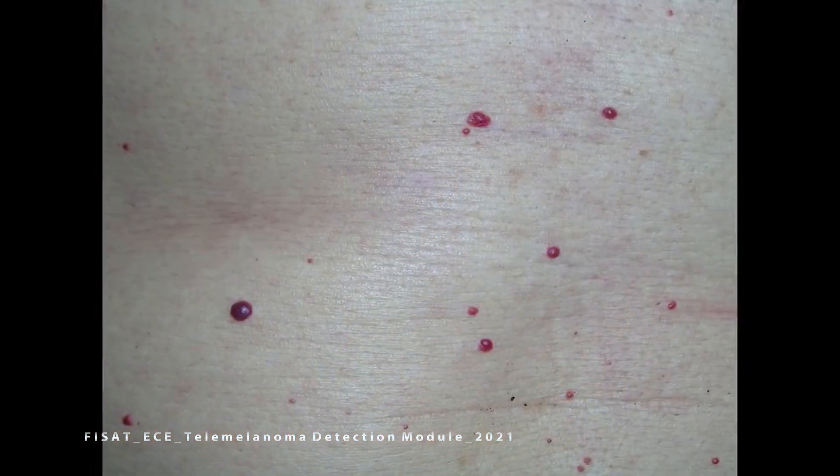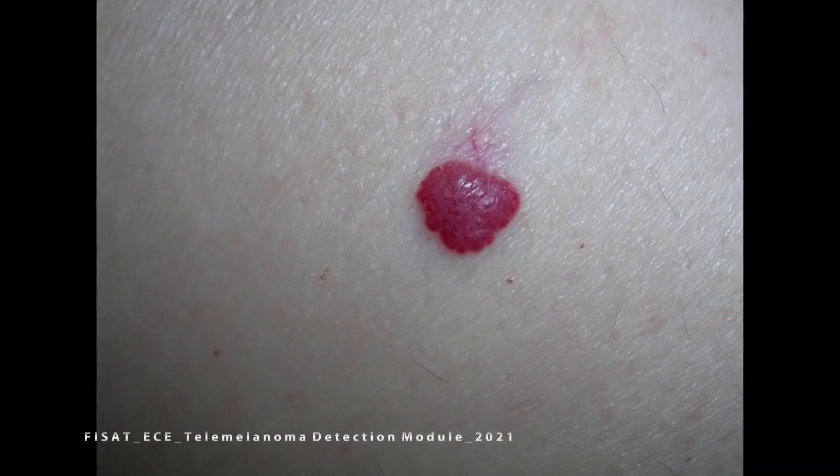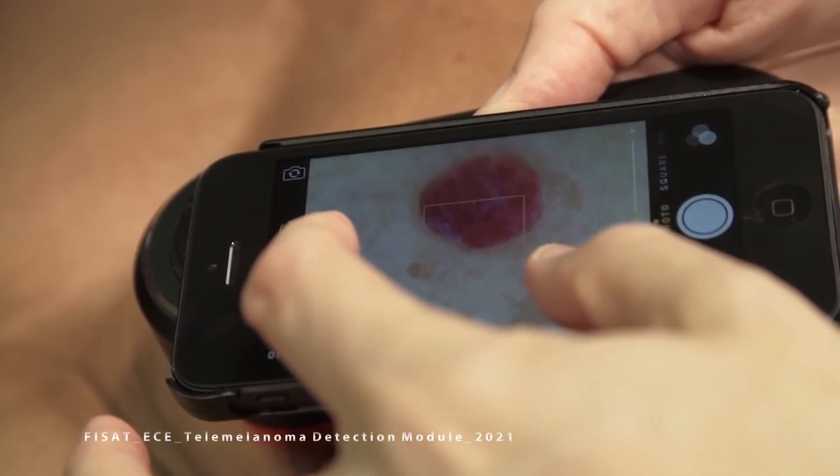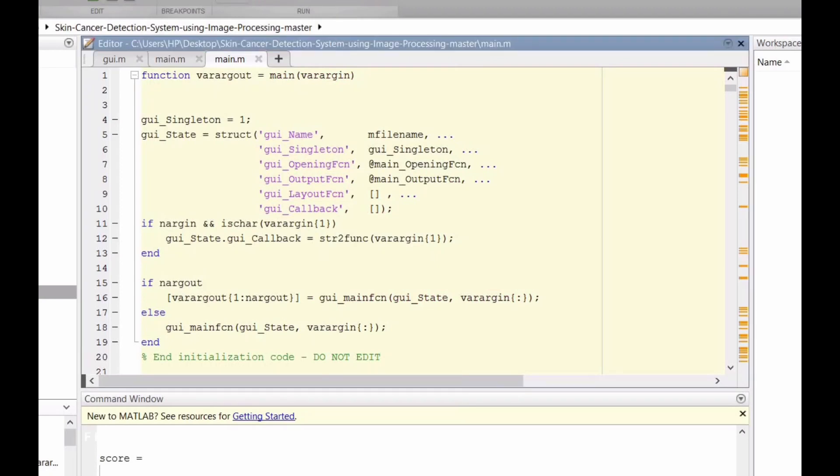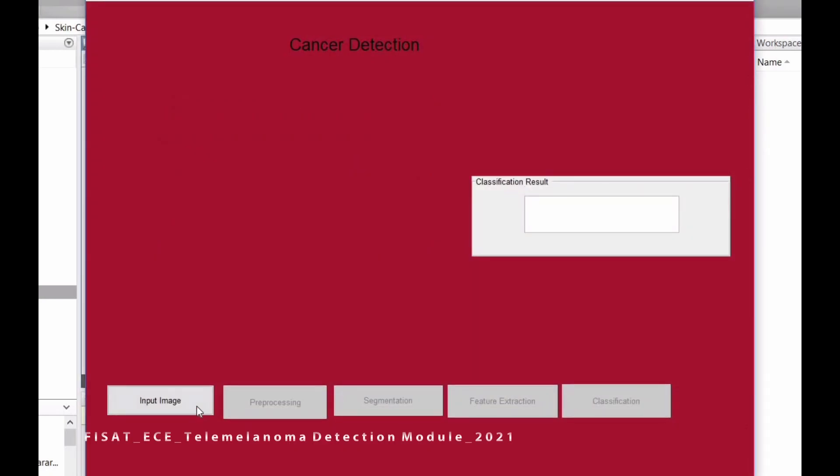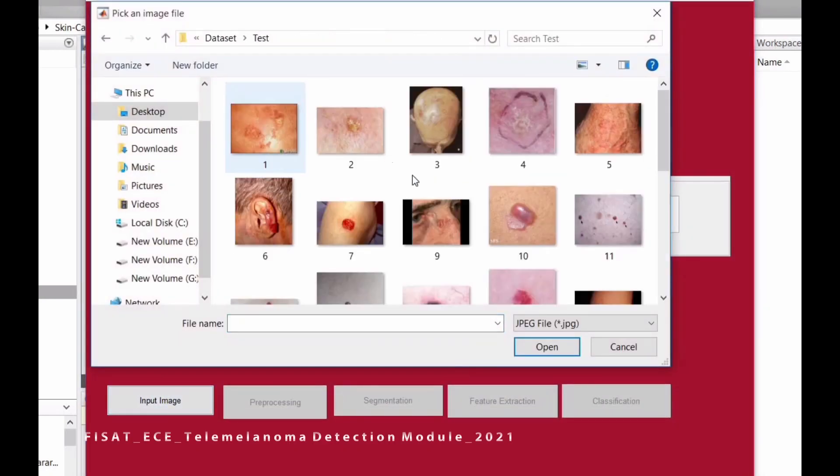This can be performed using MATLAB software. The PH2 dermoscopic image database is used for testing purposes. We capture the image using a high-resolution camera and provide the test image as input.